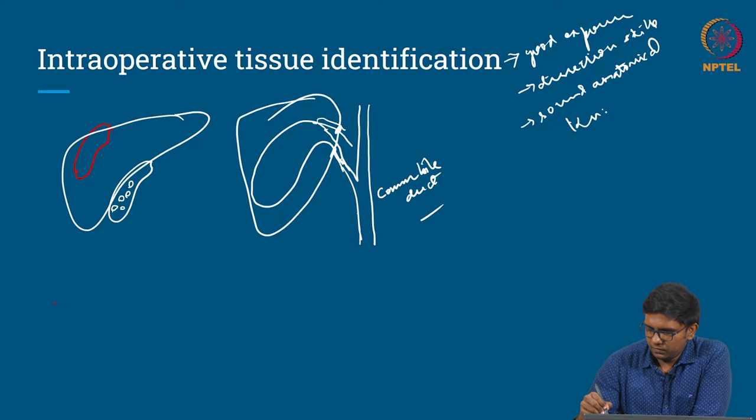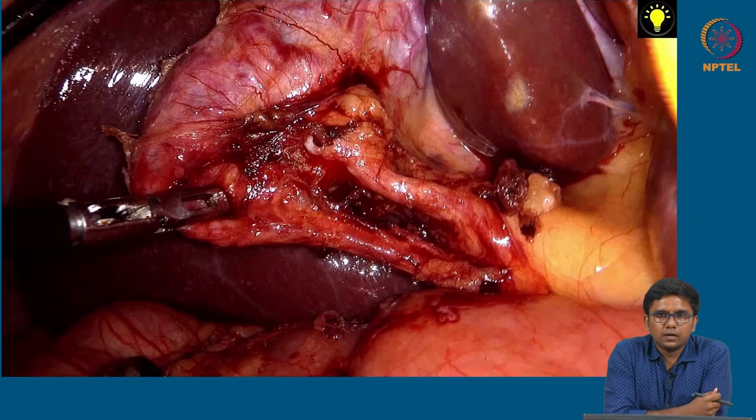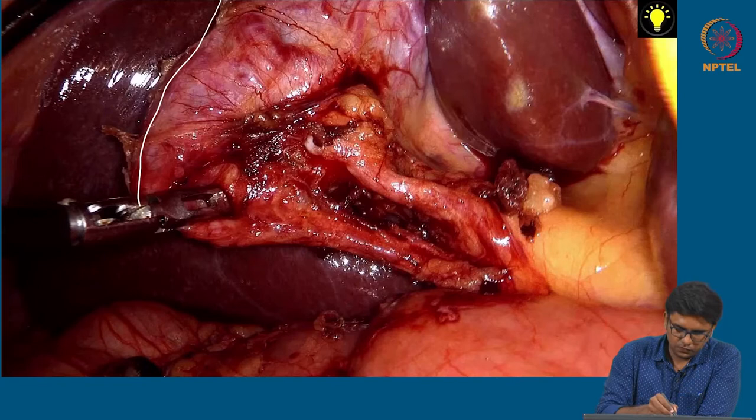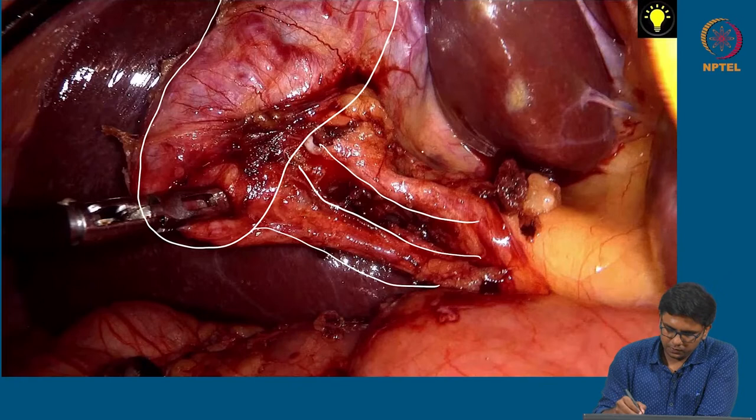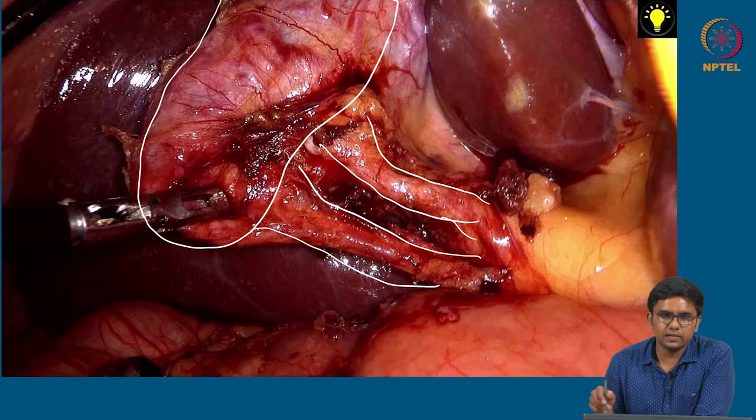Let us deal with one example. This is an intraoperative picture of a gallbladder removal surgery, cholecystectomy. This is the organ we are going to remove, this is where the cystic duct goes, and this is where the cystic artery goes. In this particular surgery the dissection has been done quite cleanly; we do not get to see the common bile duct anywhere else, so the surgeon can very well cut it off here and take the organ out.